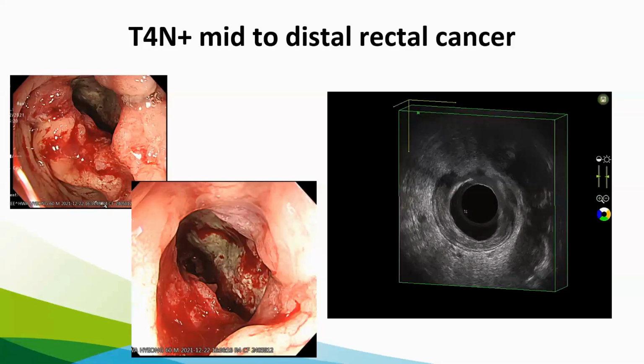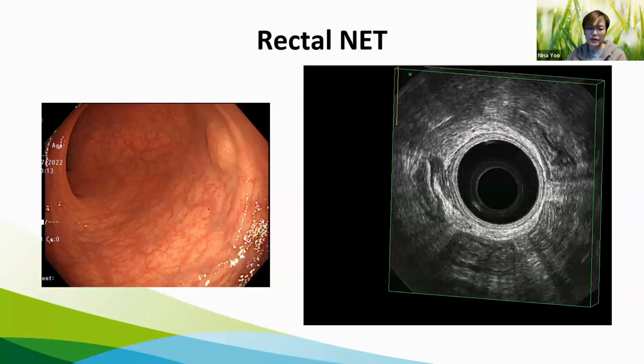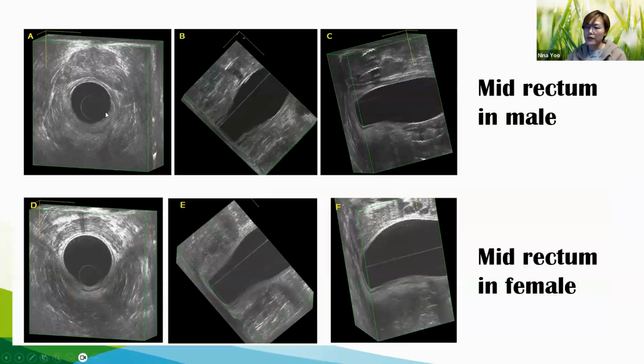The next question is actually an extension of what you just mentioned. Could you use this ultrasound scan to assess the lateral pelvic side wall? No, actually, no. You can't see the lateral pelvic side wall lymph nodes. What you can see is, if the lymph node is located on the lateral pelvic side wall, you can't visualize it.